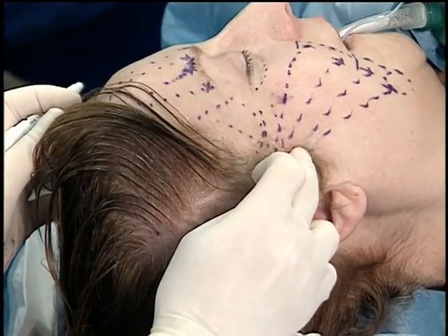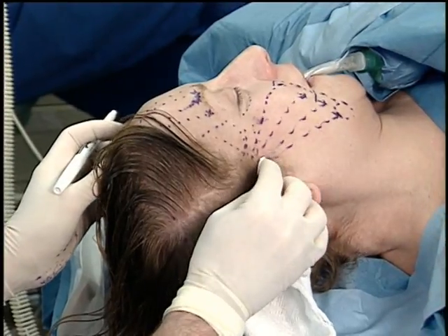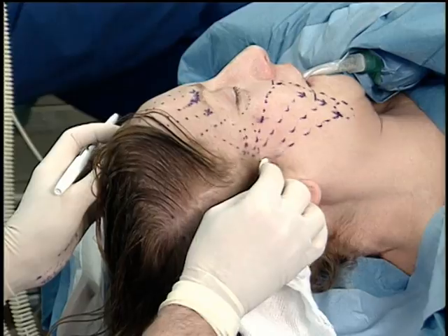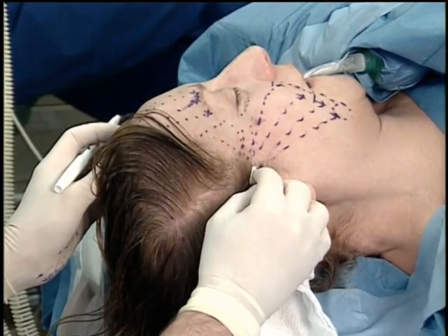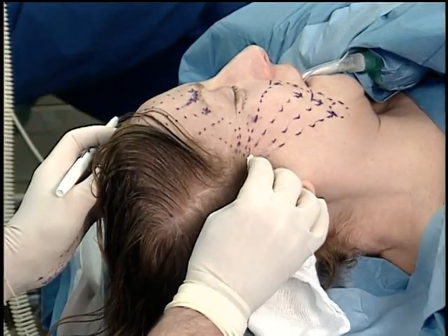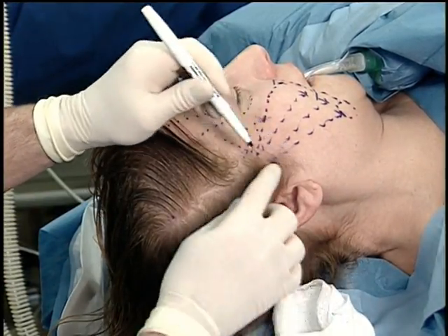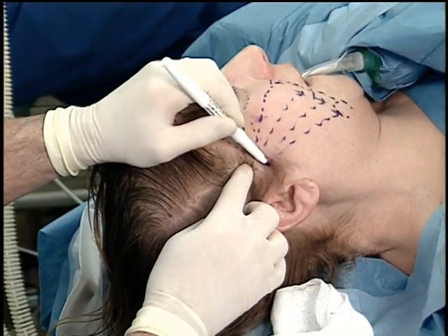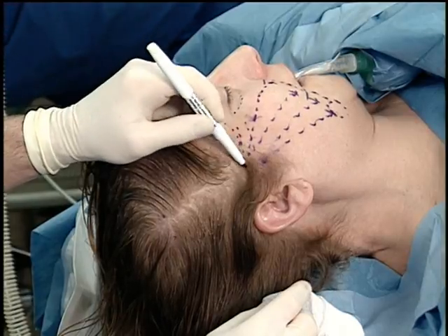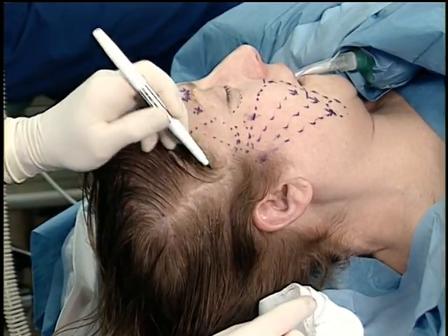If we back out a bit, you can see that at that point I get a very nice pull on the face. You can see the effect on the neck as well. If I can get a very, very strong vertical vector there during the CT1 procedure, I will lift a lot of the excess right into the scalp. So I'm going to be deploying through this common port right here a contour articulus thread that will come north into the scalp. So we'll turn that loop upside down, what I call a U-loop lift.